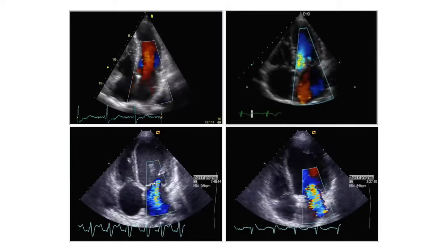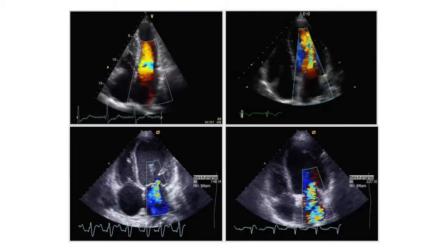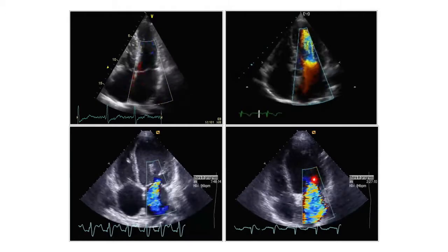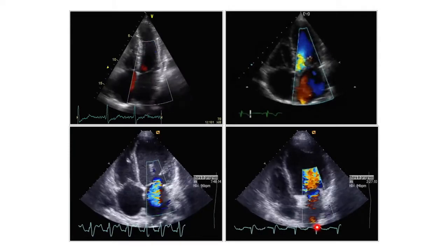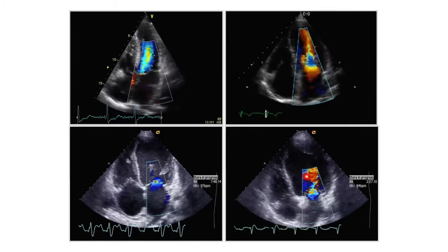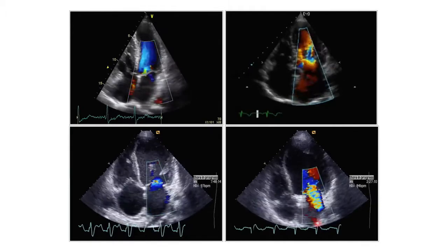And finally here on the lower right, this is the extreme. Here we have a jet which actually almost completely fills the left atrium with a lot of flow convergence zone, a lot of color. Again, mainly blue, meaning that it's going away from the transducer. And if you time that with the ECG, you would also see that it occurs during systole. That's exactly when mitral regurgitation occurs.